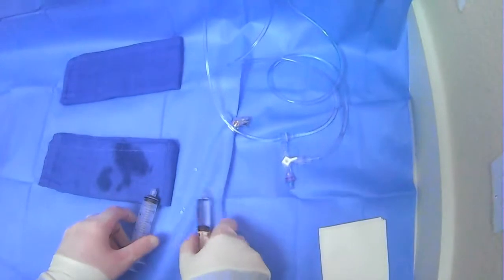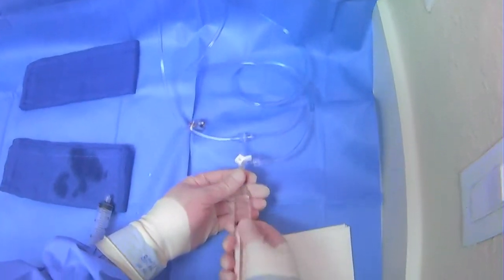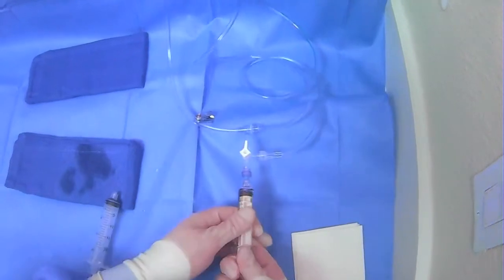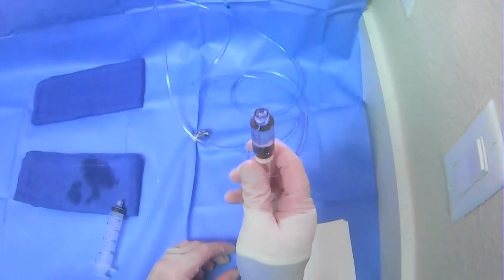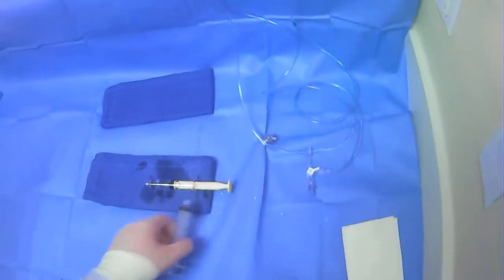With an empty syringe, you can also empty out contrast via the waste line. Get very comfortable switching back and forth and making sure you switch to get the contrast back, then push it back to the correct position so you don't accidentally flush the wrong line. That's the basics of filling up your syringes.